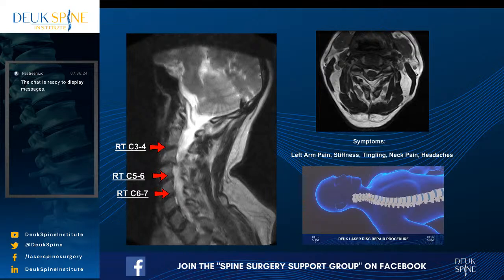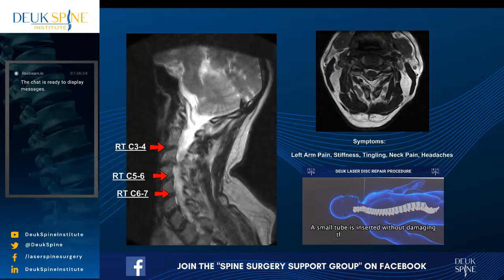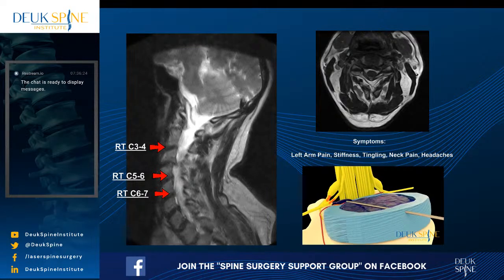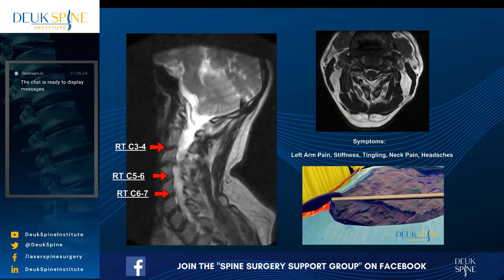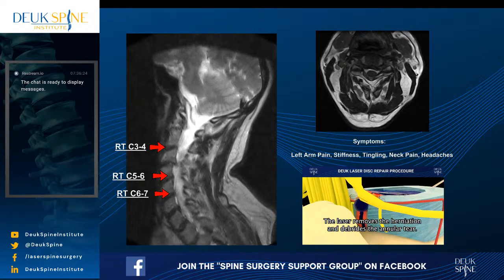Now, this patient traveled from California. He's an engineer, and he was offered fusion surgeries in California. He did not want an anterior cervical discectomy and fusion. So Diego, you want to run a little bit of the ACDF video so the crowds can see the difference.